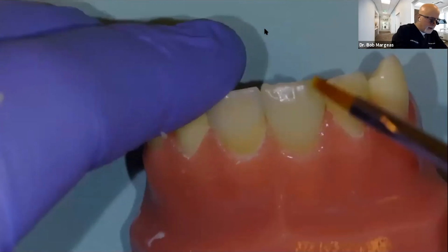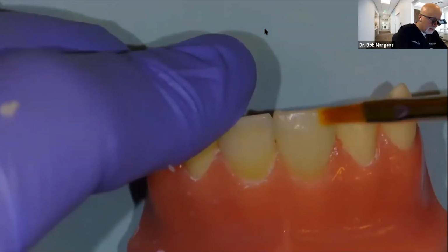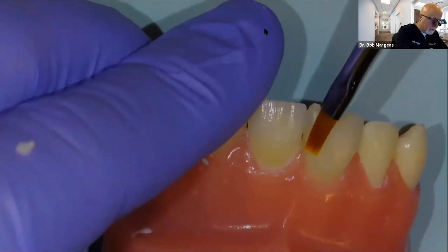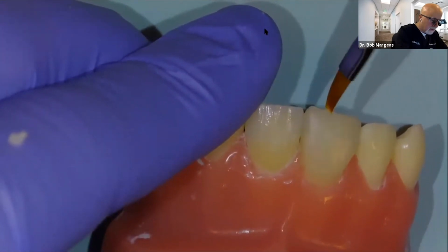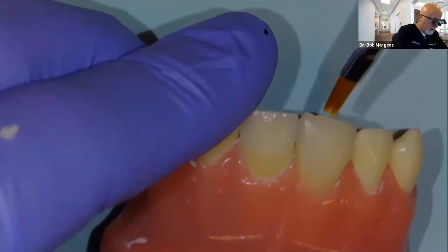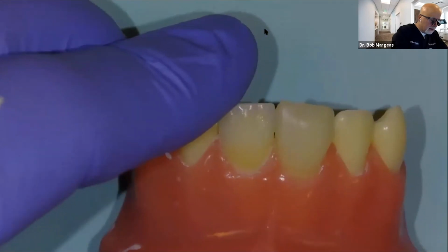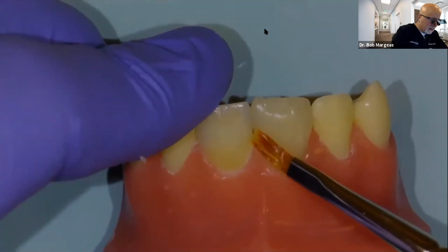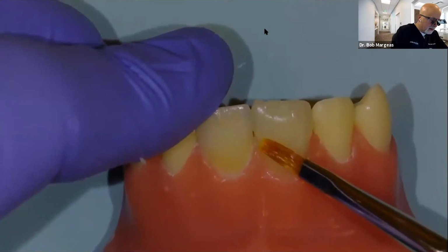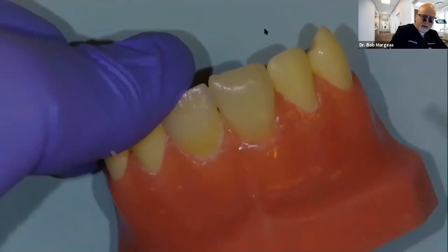So I'll use the resin blend or the brush and sculpt, and I'll move the material where I want it, and then I'll cleave off any margins I might see. If I see something that doesn't blend up here, what I'm doing is thinning it out, and then I'll cleave it off because I don't want to have any ledges.